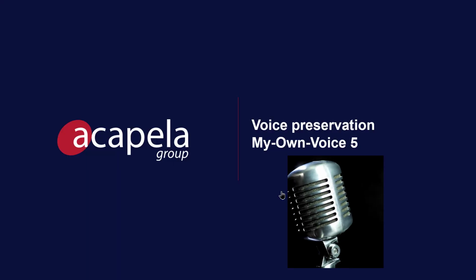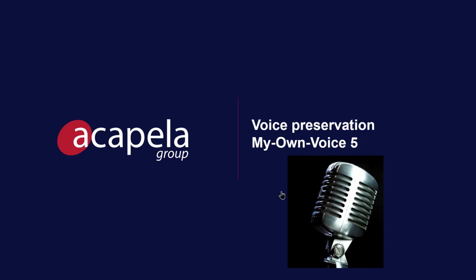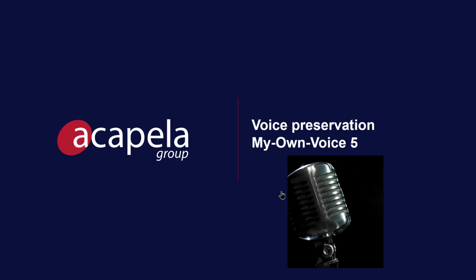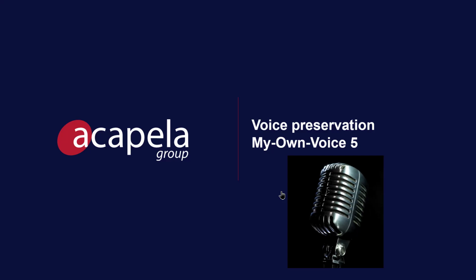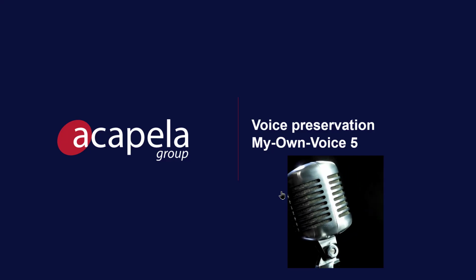I also want to talk a little bit around My Own Voice 5, which I think came out in October, but I've been so impressed with the improvements to My Own Voice, I wanted to talk a little bit about it. So as you'll know, Acapela is part of the Dynavox group, so it's important to share the work that we do together.